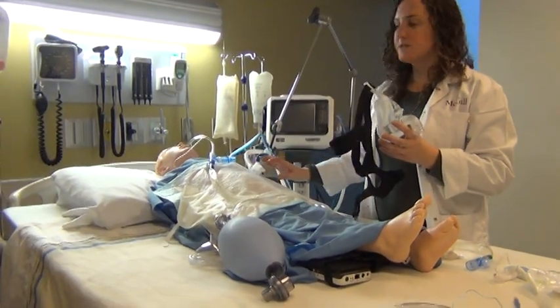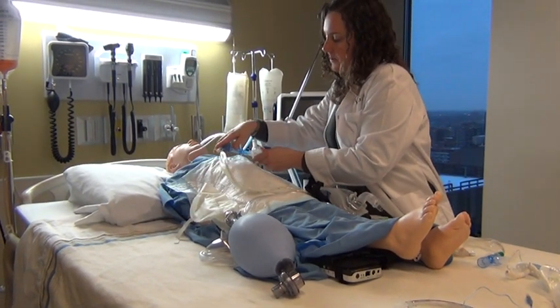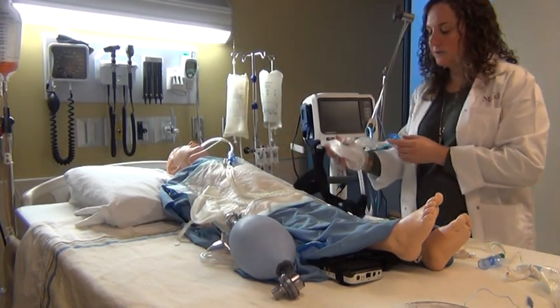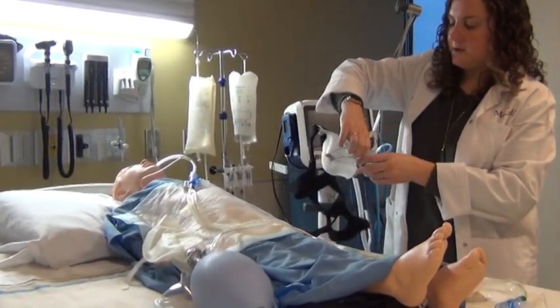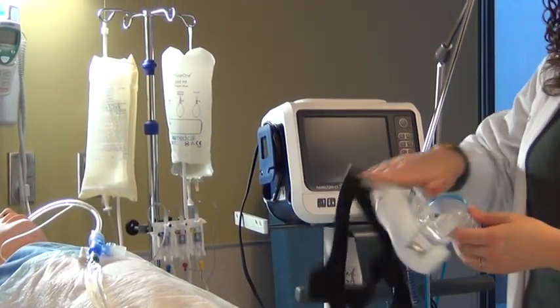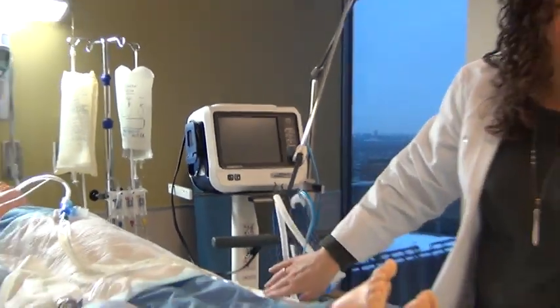And these could just help, mostly related to sleep apnea. So this BiPAP machine can be provided through the same ventilator that you would have invasive mechanical ventilation, but essentially the ventilator would connect here to a BiPAP mask, and this would be fitted on the patient's face. So this is one way of non-invasive mechanical ventilation.